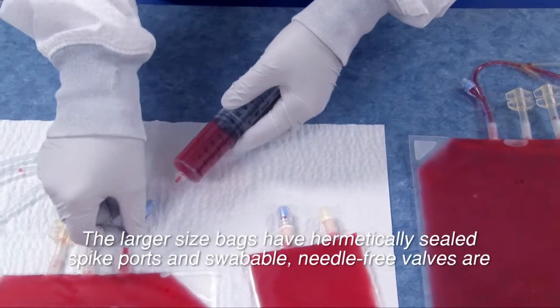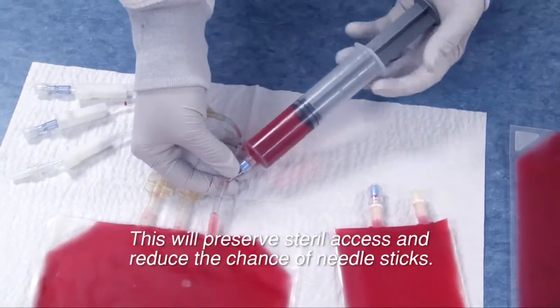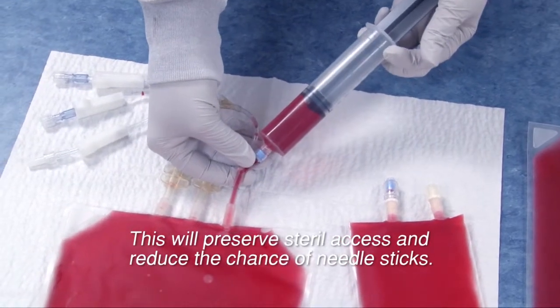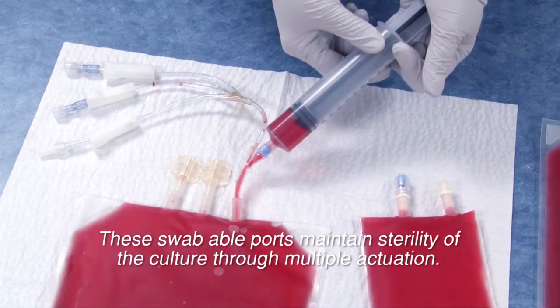The larger size bags have hermetically sealed spike ports, and swabbable needle-free valves are provided on every bag. This will preserve sterile access and reduce the chance of needle sticks. These swabbable ports maintain sterility of the culture through multiple actuations.